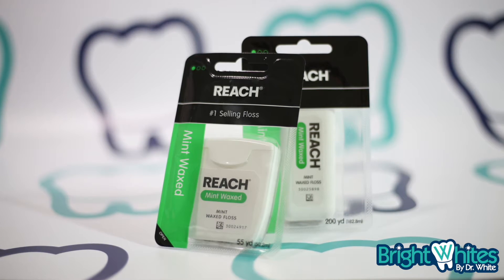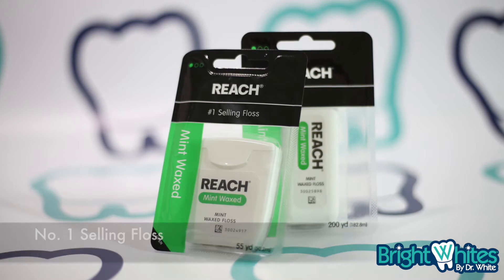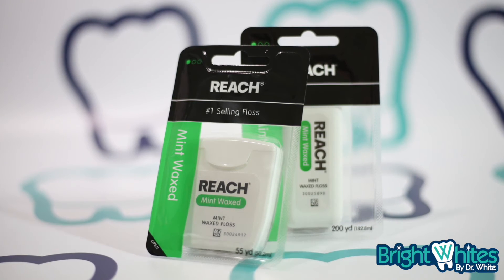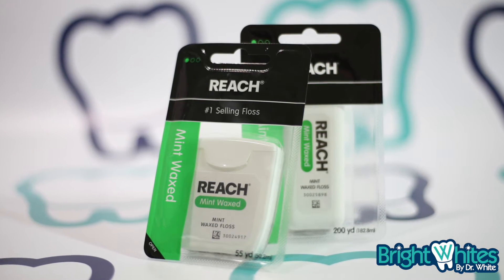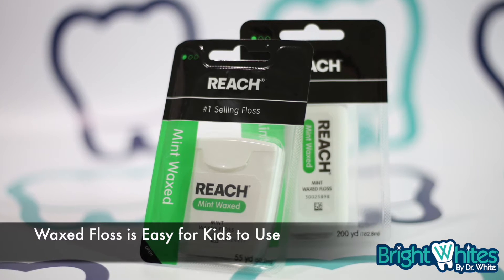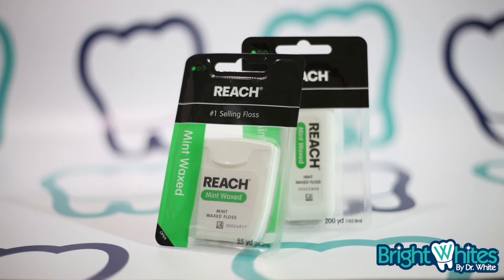I've used Reach Floss for decades. It's a trusted Johnson & Johnson product advertised as the number one selling floss. I prefer the mint wax type because it's easy to manipulate between your teeth. Especially for children's teeth, the wax cord easily slides in between natural teeth and softly engages the gums.